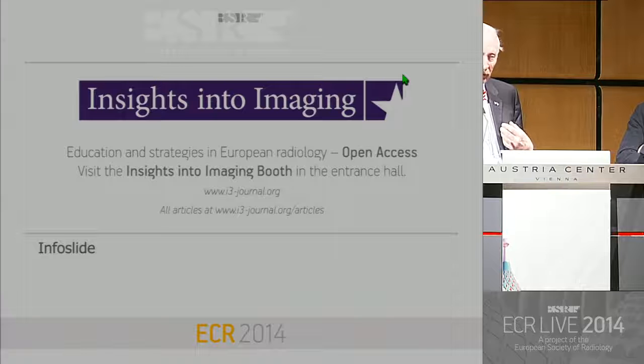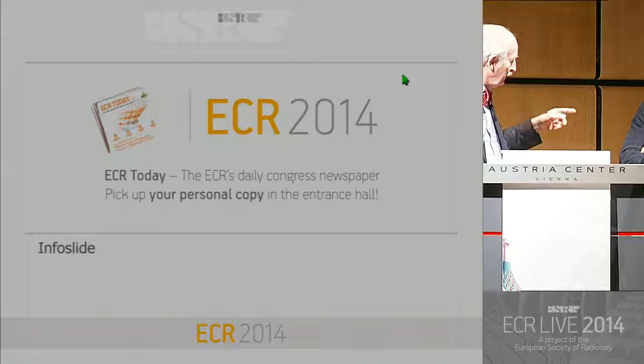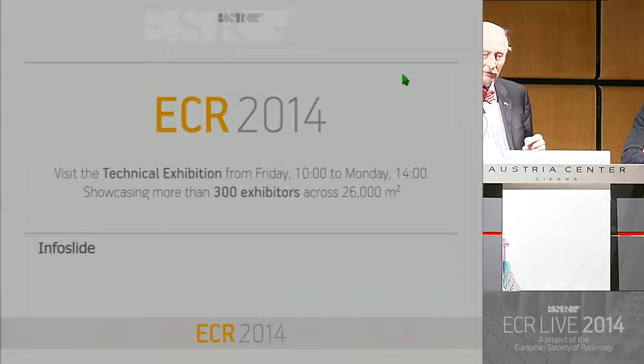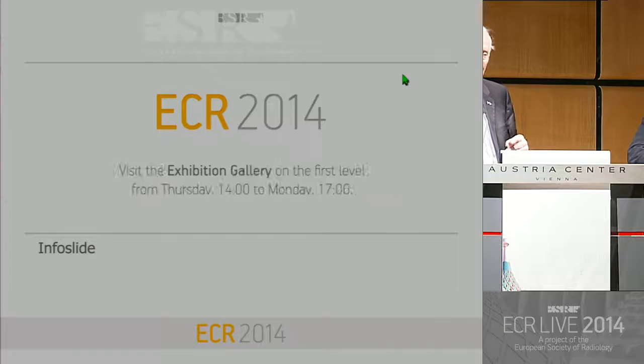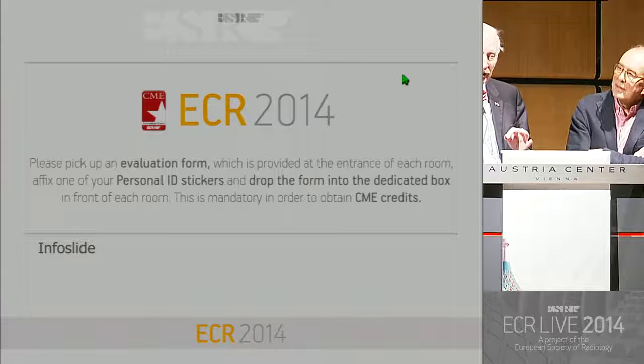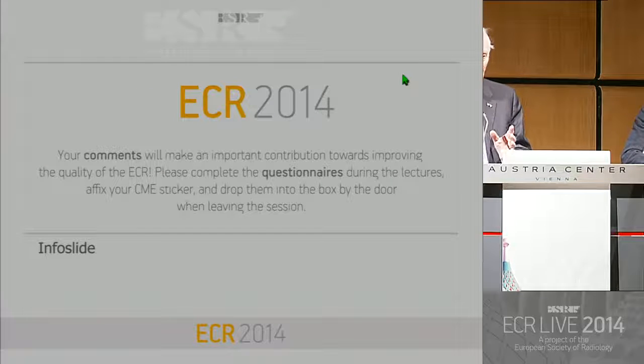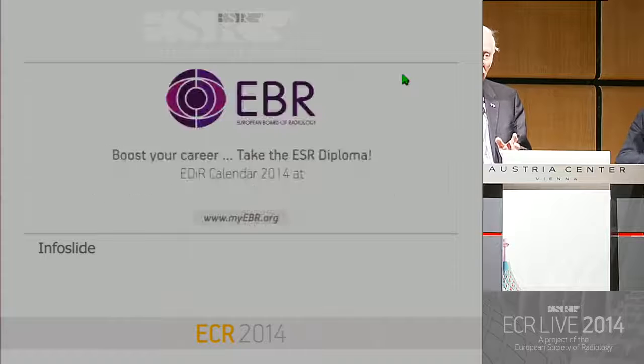Now, at this moment, we have a study going in Rotterdam, which is using the technique you described, the dynamic fusion technique, and we are doing 12 core biopsies on everyone, and then we do an MRI-guided biopsy, blinded, so a different person in the same session gets the MRI information.